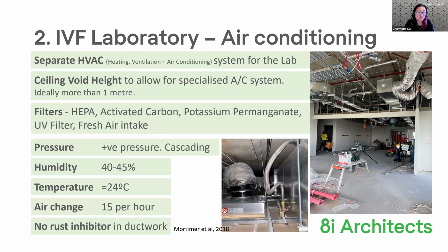In cases where it's extreme disaster, you would generally want to actually turn off the fresh air intake. You want to be able to separate that fresh air intake, because no amount of filtering, if the air is thick with smoke and ash and particulates, there's not much an air filter system can actually do to be able to remove all those contaminants before it goes into your lab. So having a separate shut off for air intake in extreme circumstances is actually quite beneficial for a lab.